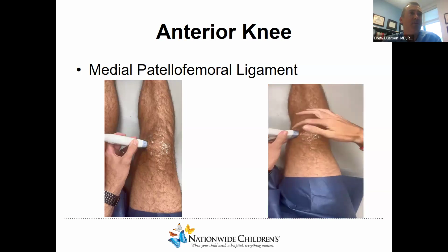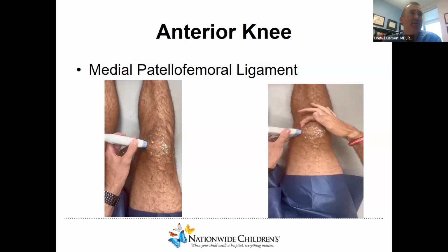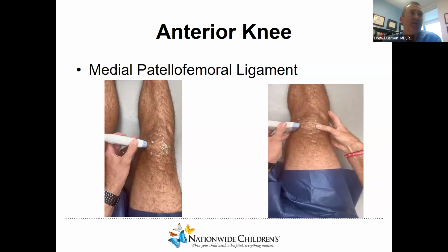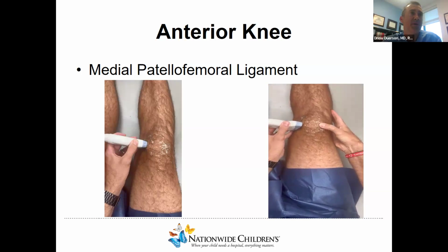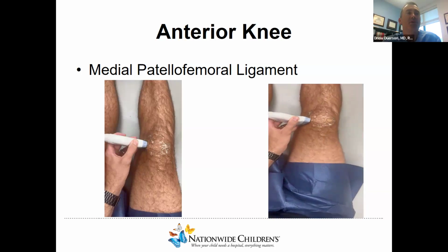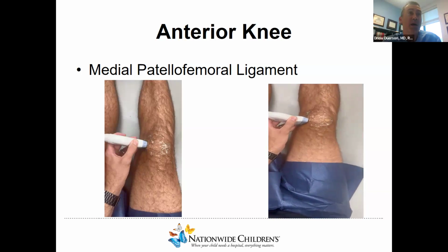The second video will be my dynamic scan, where I've found my medial patellofemoral ligament, and I'll want to provide some lateral stress to the patella to see if there's any instability. This will help me differentiate between any partial and complete tears. And then also providing a little downward pressure on the lateral patella will add some tilt to the patella, and I'll be able to better see that medial facet, which we can already see better than the lateral facet, but with this provocative maneuver, we can see it even better.